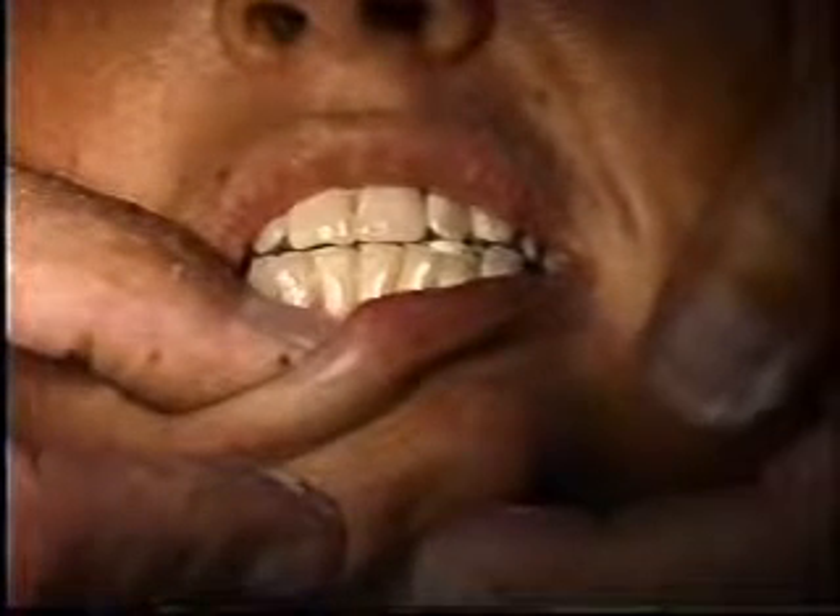Slide a little bit to the left — just right there. And that way, these bicuspid inclines that are building in the pads will retain this position when the anterior ramp is removed.